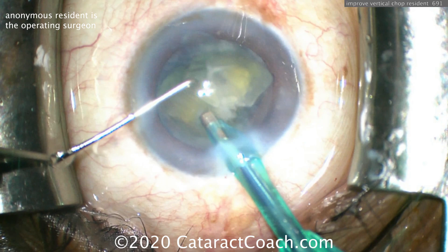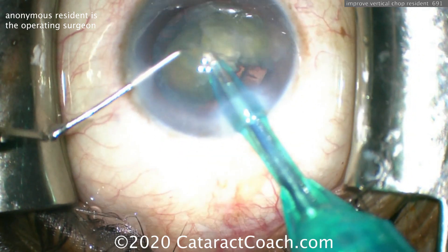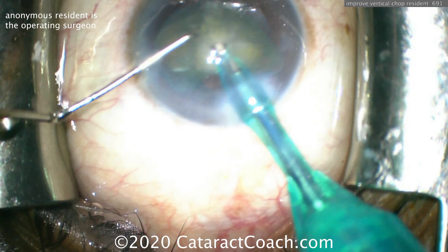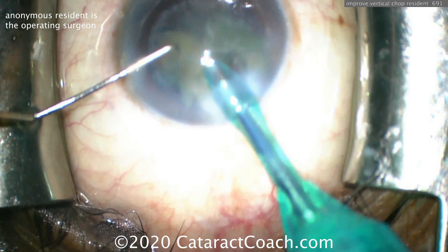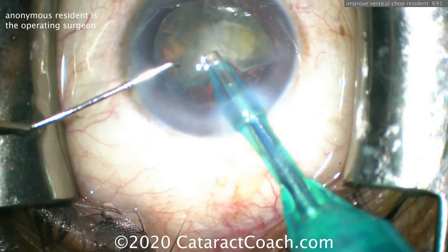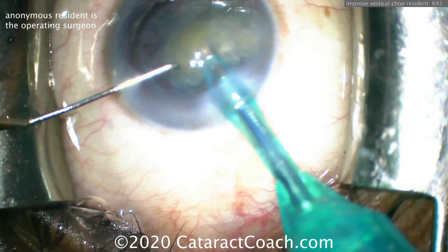Maximize the bottle height — see that snap sign? This is a good video to learn about post-occlusion surge. Increase the bottle height, young doctor. Or perhaps decrease the aspiration flow rate or even decrease some of the vacuum level, depending on what type of phaco pump you're using.